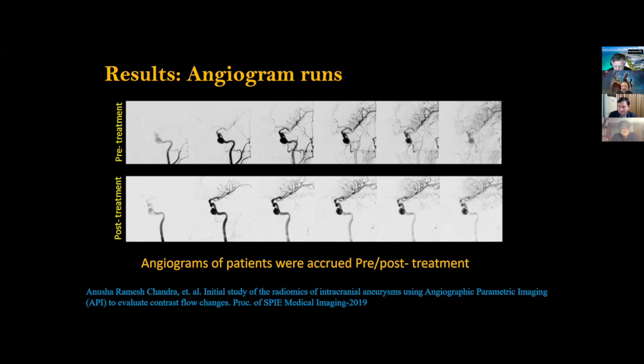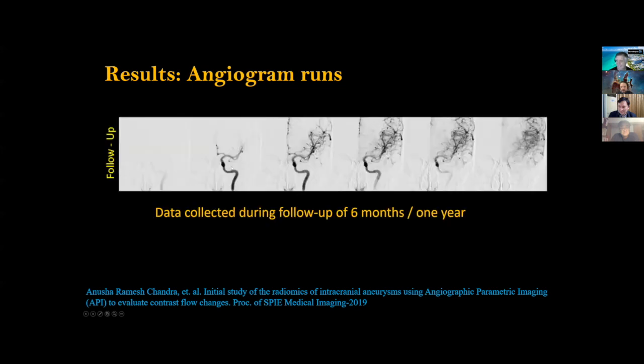In general, the surgeon is looking at them and qualitatively saying, I think I'm done, there is not much I can do in here. If he decides that it's not done, some of them, like Dr. Siddiqui, sometimes place a microcatheter into the aneurysm dome over the pipeline before deployment and decide to drop a coil in, or a second coil in. Or he is wondering, you know what, I think this device doesn't have quite good wall apposition, and goes with a balloon and inflates it slightly to make sure that the pipeline device has full apposition with the aneurysm neck. Based on these images, they have to decide. And as you can see in here, at 6 months follow up, this is gone.